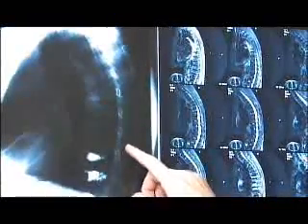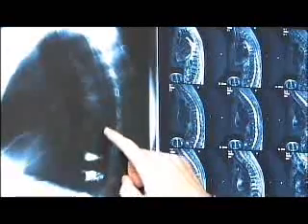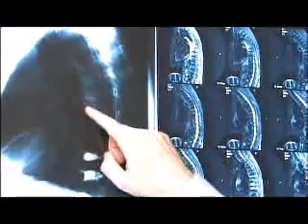In this case, this patient presented with severe mid-back pain. Plain radiographs were obtained in our office that showed evidence of compression of the vertebrae. Here's the same vertebrae now post-procedure, which is now squared, as would be for a normal vertebrae, in comparison to the initial radiograph where we see a very triangulated nature of the vertebrae. So in this procedure we have reduced the fracture to a more anatomic, normal position.